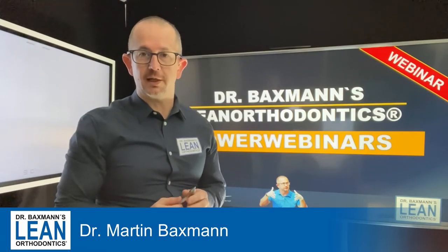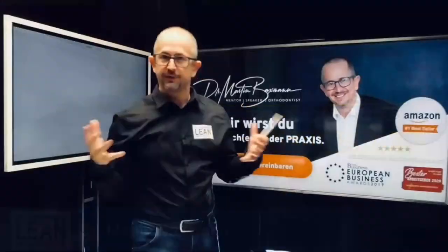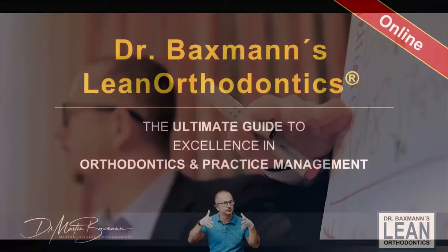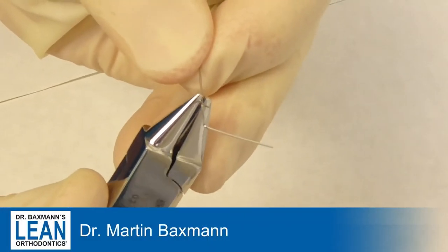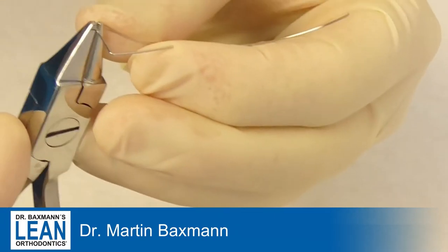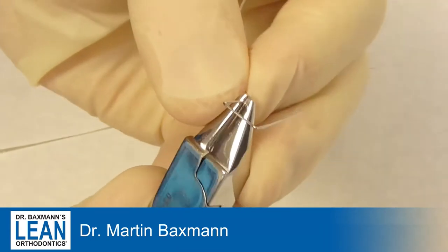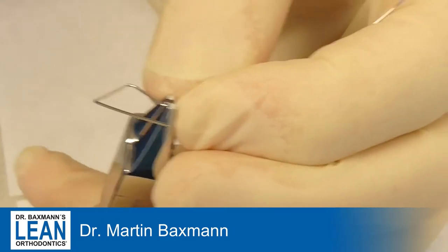What you need for today is 018 stainless steel wire and a loop bending plier. What you will see later on is a previously palatally impacted canine in the upper jaw, which is now erupted in crossbite. We are going to do some wire bending to bring it across the lower teeth to go over the occlusal plane.